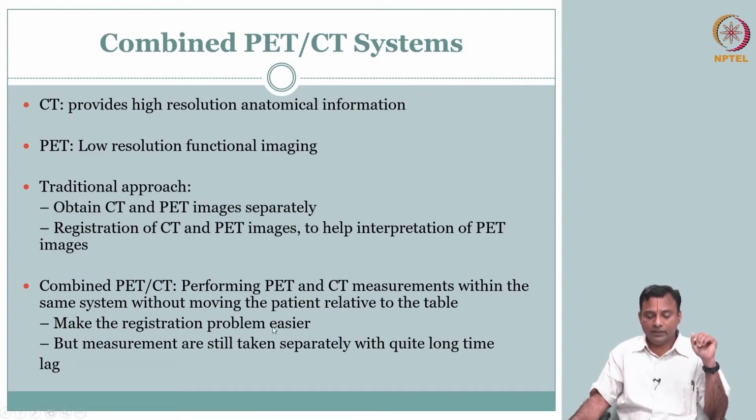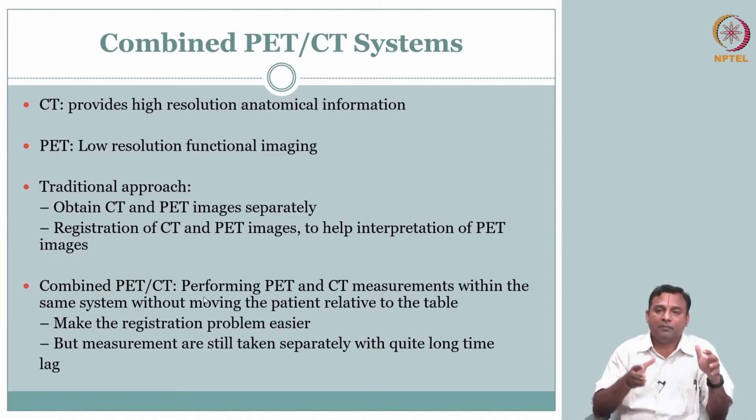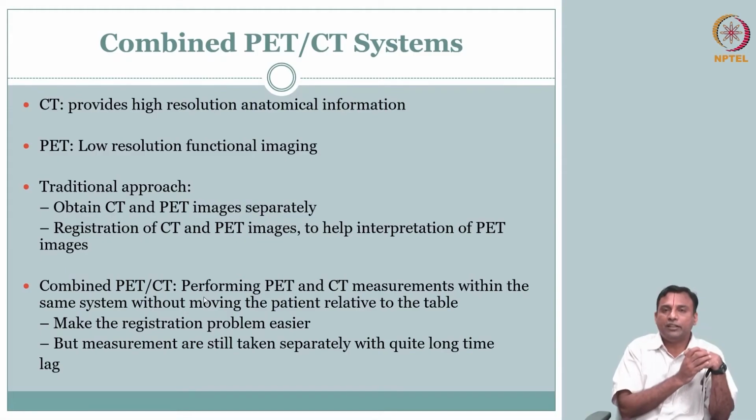That way it might be easier to do the registration. Of course, you can do the reconstruction later. After you acquire the data, you could still go back, or you could have some gating like we discussed. So we could always do the reconstruction later, but at least acquisition can be done simultaneously or by the same location. You don't have to move the patient to different instruments.